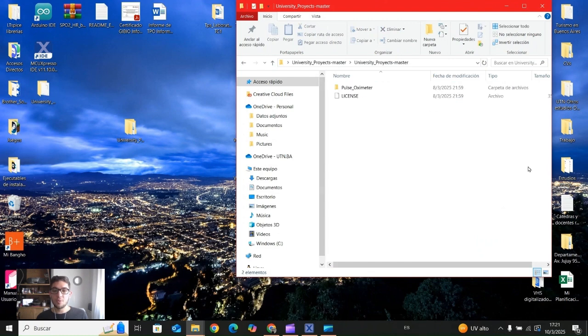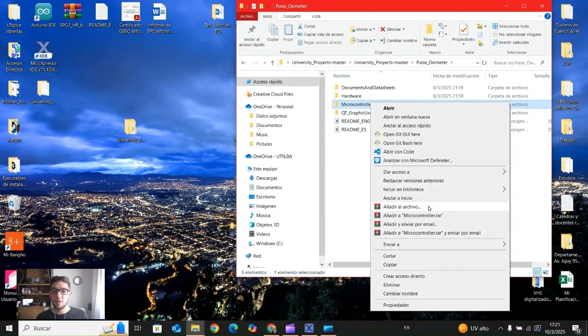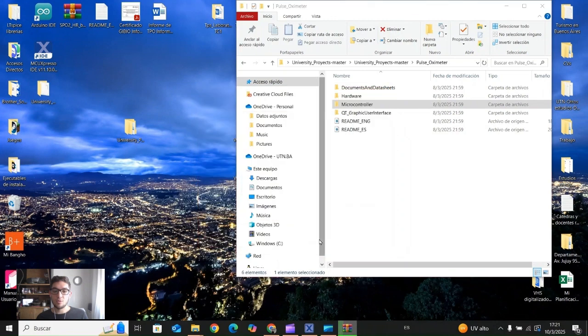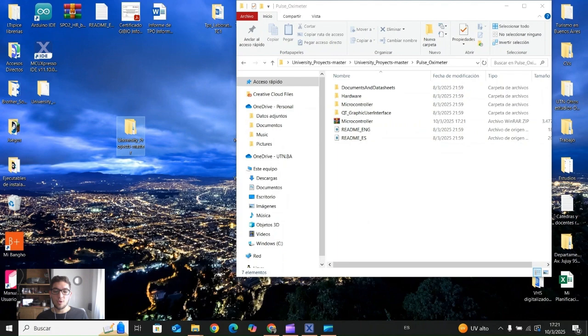So we go to University Projects, then PulseOximeter, then Microcontroller. This folder we need in zip format. So we go to here, then we click on zip. We maintain the same name as the zip file and the folder. Click on accept. Then we have microcontroller.zip.